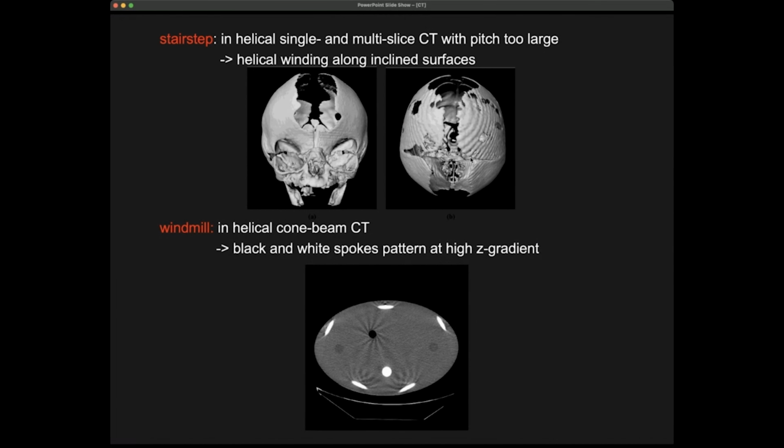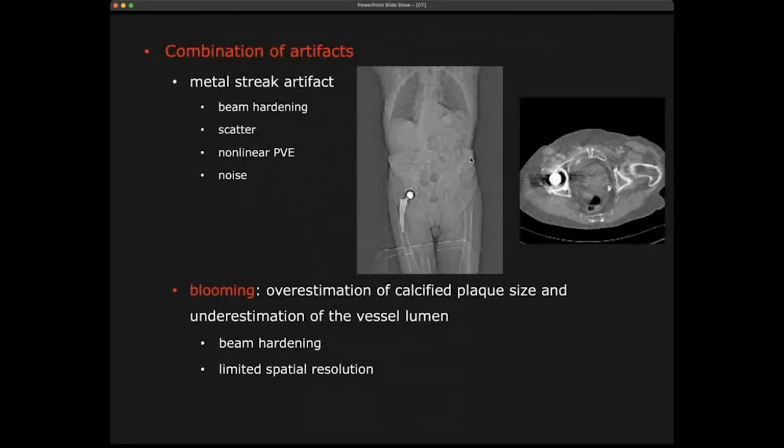And also when we do further processing, we have to keep in mind what the artifacts would be. As I said before, for example, metal gives a lot of artifacts, and here it becomes important when we interpret the image. Here, for example, we have a metal hip, so this is a hip prosthesis, and it looks dark surrounding it. So the question is: is this gas around it?